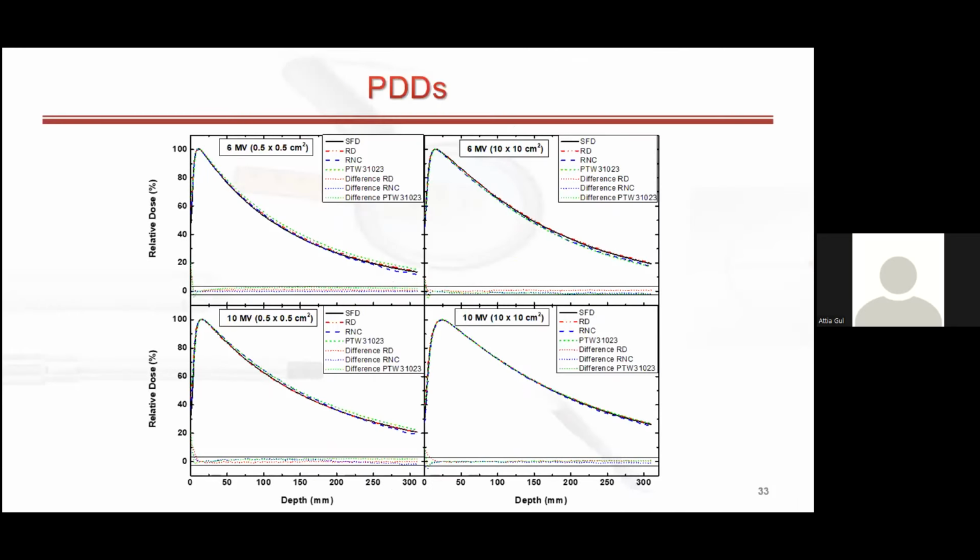For PDD, all detectors that were used in the study are equally good; the difference in response is less than 2%. So for PDD, we can use any detector.